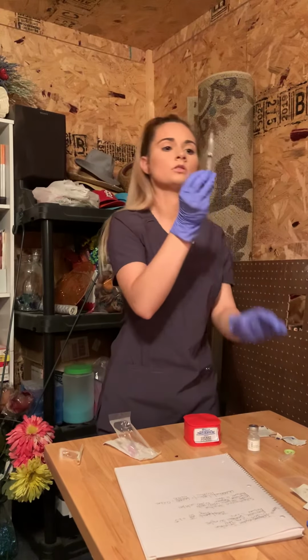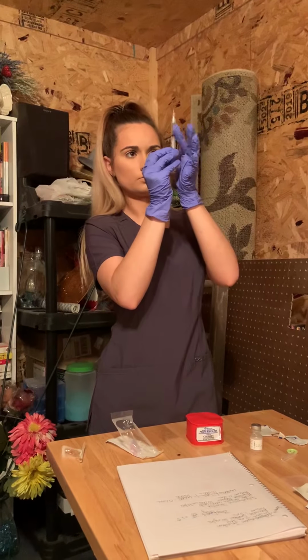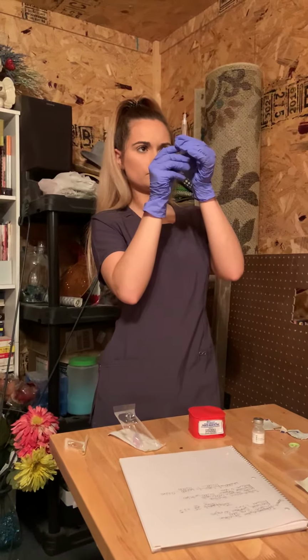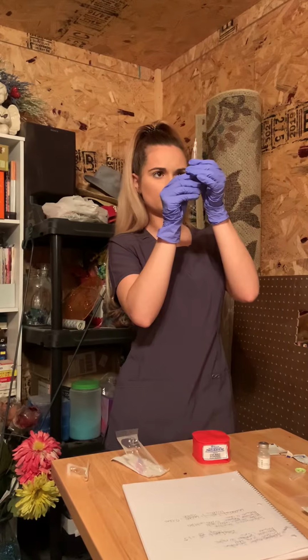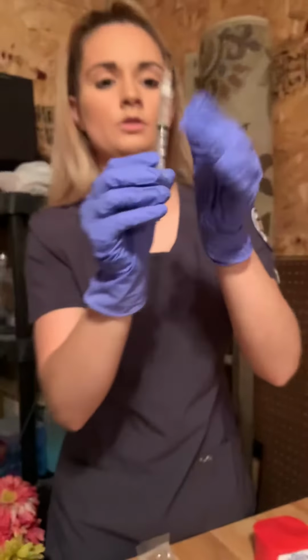Get all the air bubbles out, and make sure you have the right dosage.